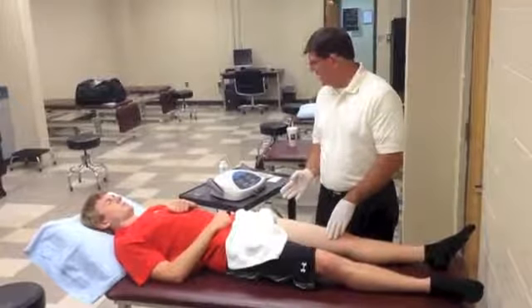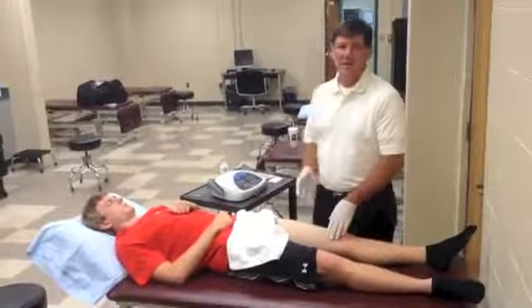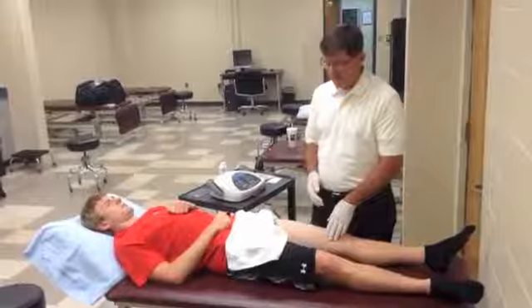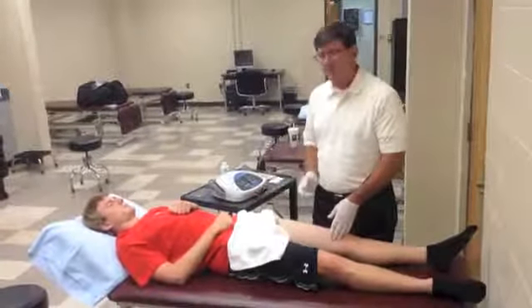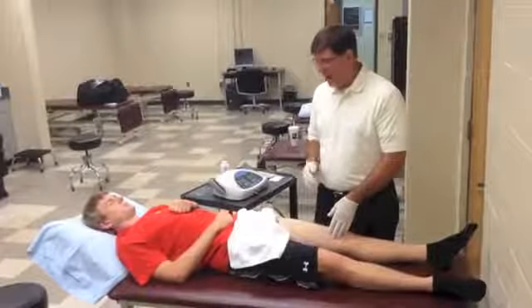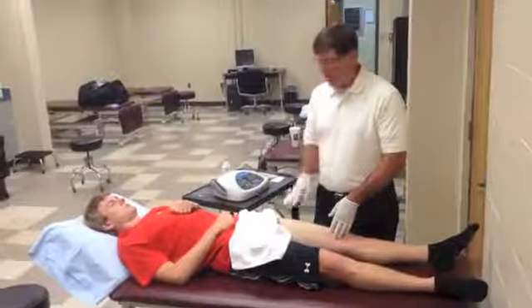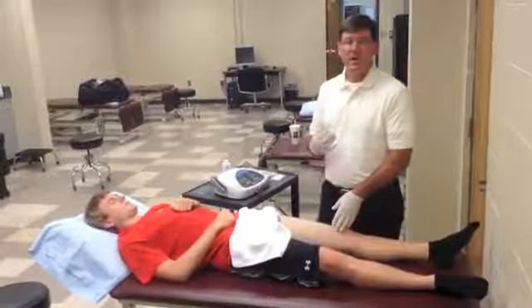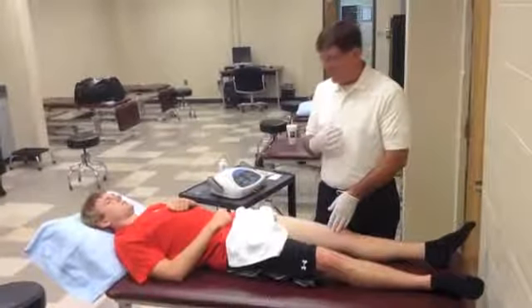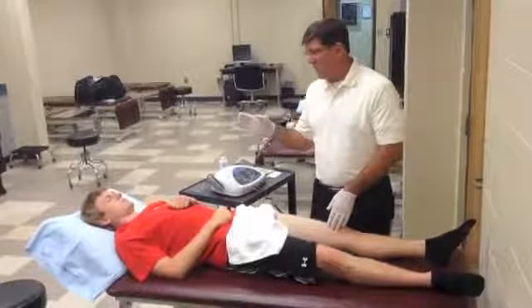We're going to use the deep tissue oscillation to treat this, and it is very much a manual type of technique, but it includes electrical stim. But this electrical stim is a little different. We're actually not transmitting electrical stim to the patient as much as we're establishing a circuit in me, the clinician, as well as in the patient.